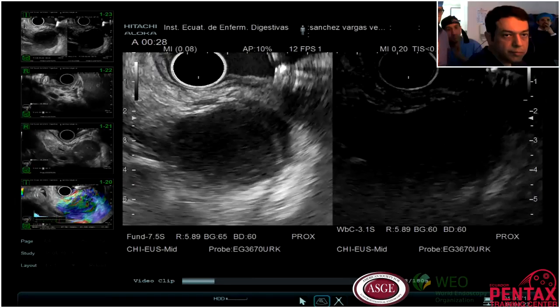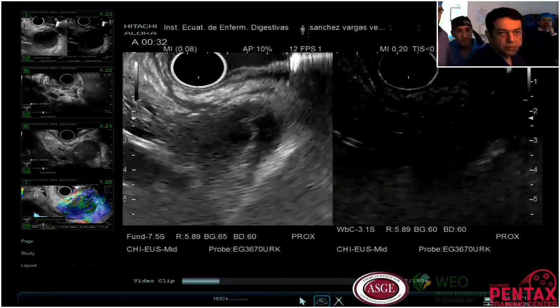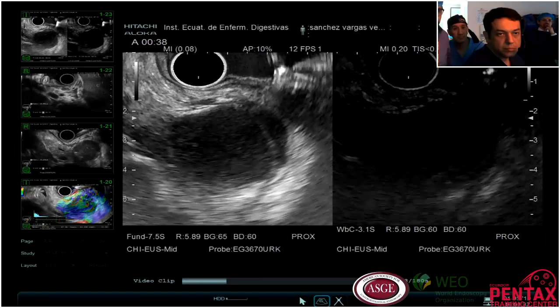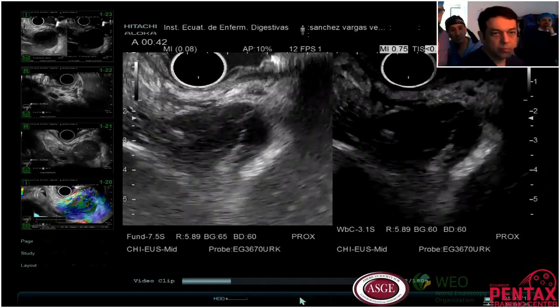So you can see there is nothing inside. I think it's a pseudocyst.